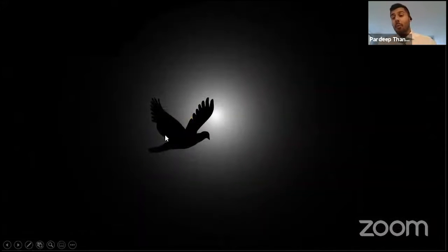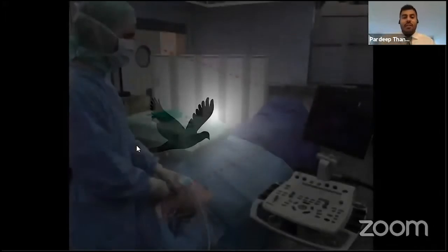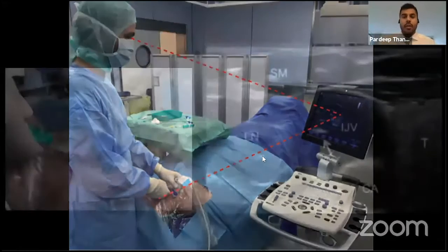And that is particularly important in patients that have underlying malignancy, or our sick patients who are already more prone to having DVTs. Okay, but say the vein is patent and your patient's not at high risk for DVT. Why fly in the dark when you don't have to? Ultrasound allows you to see exactly what you're doing in real time.